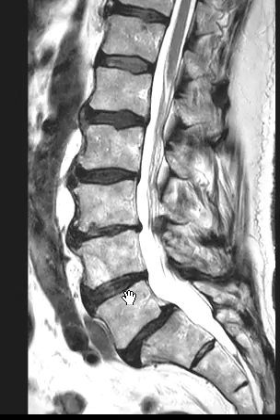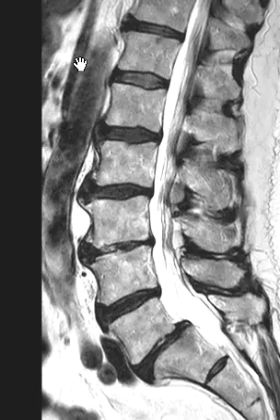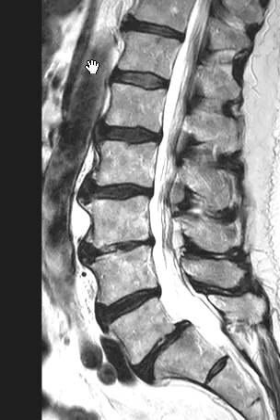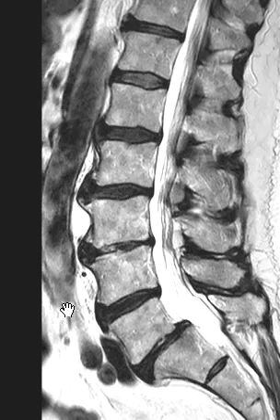But this is not what I'm showing the case for. I'm showing the abdominal aorta here. I always look to make sure they don't have an aneurysm, and it looks perfectly fine.